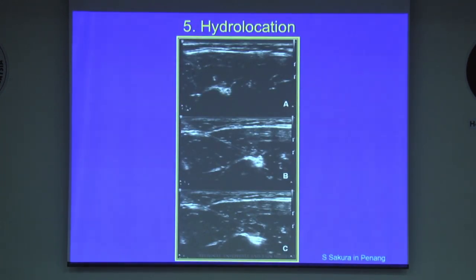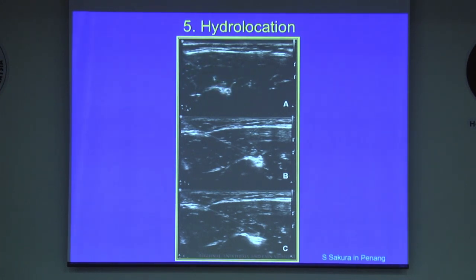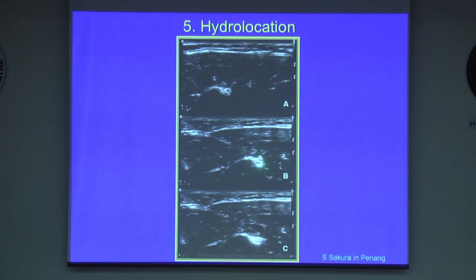Another measure to locate your needle is the hydrolocation technique. You insert a small amount of local anesthetic and see the signs of spread to indicate where the tip position must be. Here, a 22-gauge needle is inserted toward the musculocutaneous nerve, which is not clearly seen. But when a small amount of fluid is injected, that can tell you where the needle tip is. You can confirm the location next to the nerve.